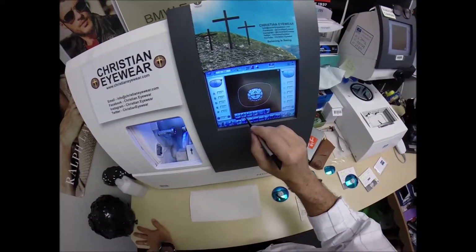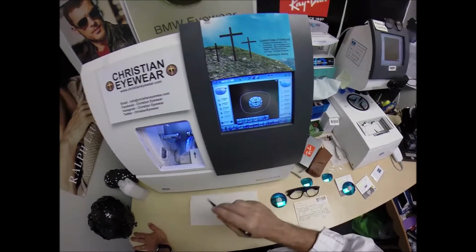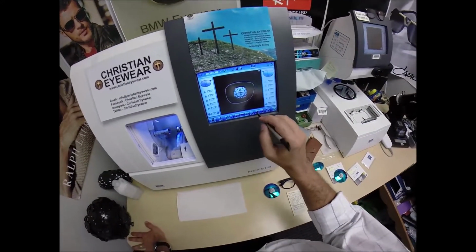Now, these are polycarbonate lenses. If they were not, if they were plastic, high index plastic or Trivex, I would select that material, but we're going to stick with polycarbonate. It's my lens material of choice for many reasons.